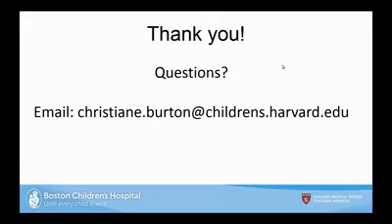So for the pediatric patients, could you threshold or get rid of the couch just by its position because you know the couch height? It has more to do with the fact that the patient is just skinnier. But you should know where it falls on the scout, right? Could you just automatically not include stuff on that part of it? Oh, I know what you mean. Yeah, it's because there's a gap between the patient and the couch itself. No, because of the couch height. So you have the couch height in the DICOM data. Shouldn't that then determine where on the scout image the couch top falls, so that you could exclude it when you're trying to get your AP and lateral separation?